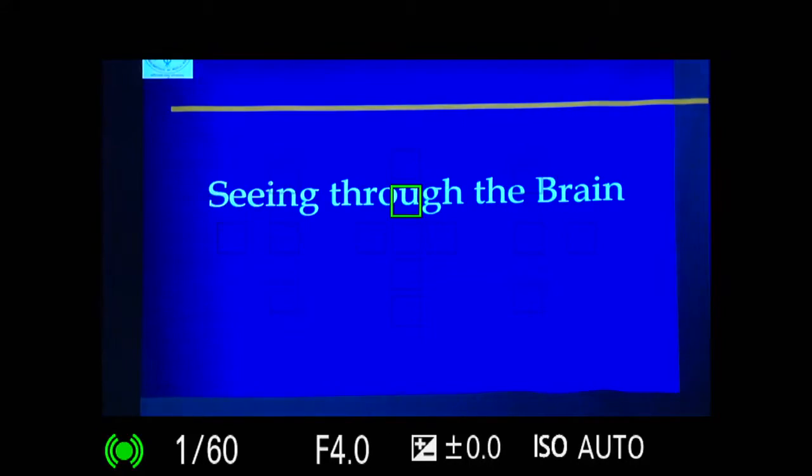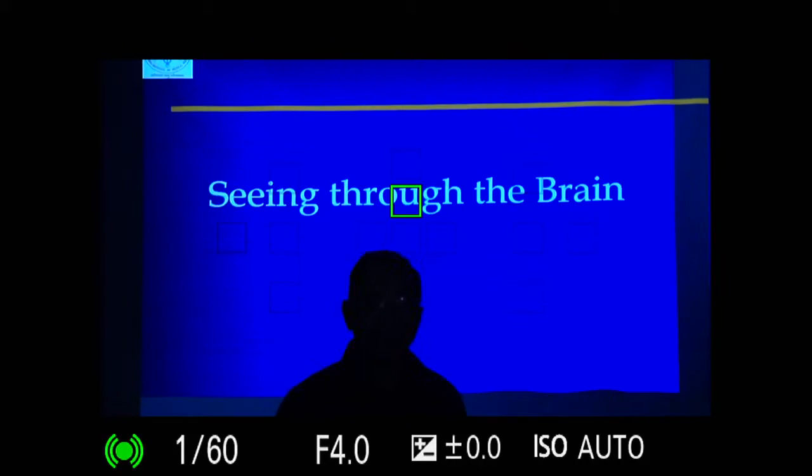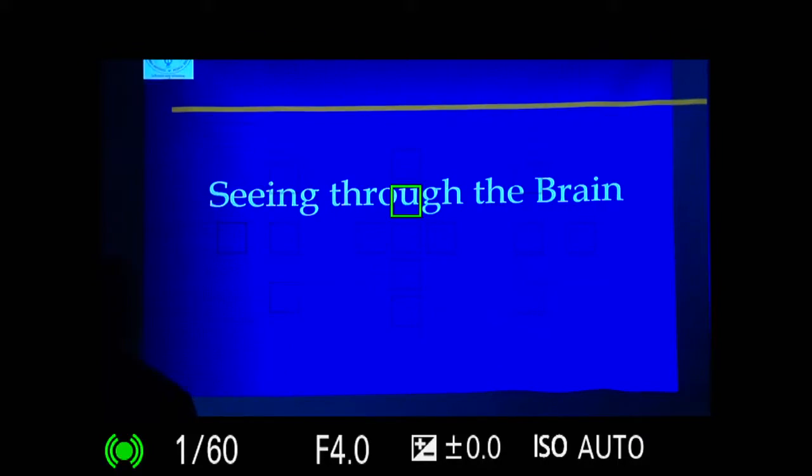Now can we see through the brain like we see the liver or spleen? There are two scenarios, in patients whom we have operated upon. What is the surgery neurosurgeons do? Decompressive craniectomy. So what is decompressive? You remove the bone flap. So once you remove the bone flap, the organ inside, the brain, that's only one organ, is visible to you like the liver or the spleen. You understand? So it's very easy, and these patients frequently come back to emergency with some problem or the other, and you need to rule out complications.